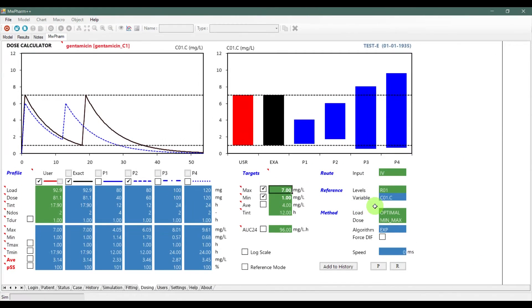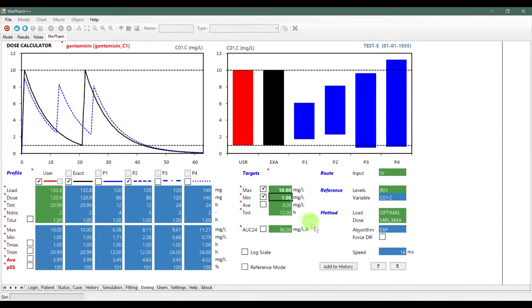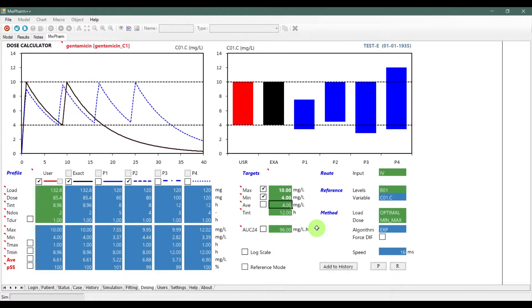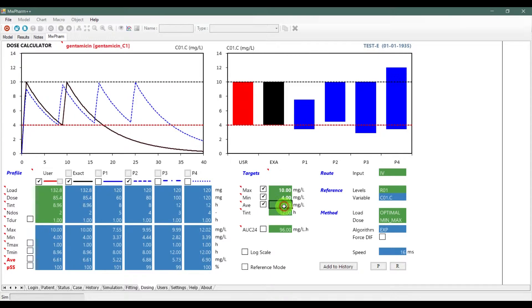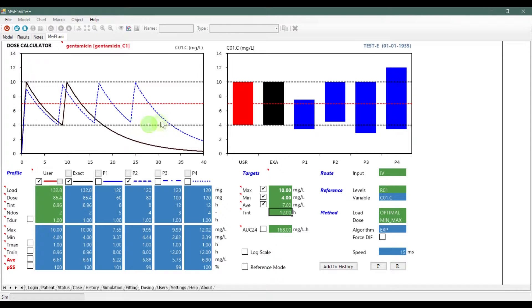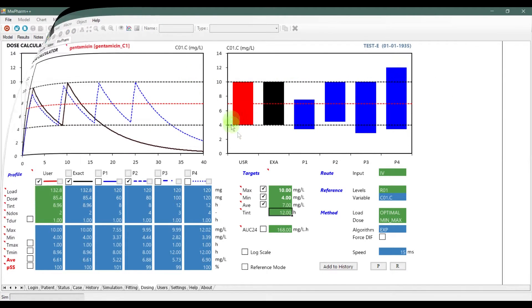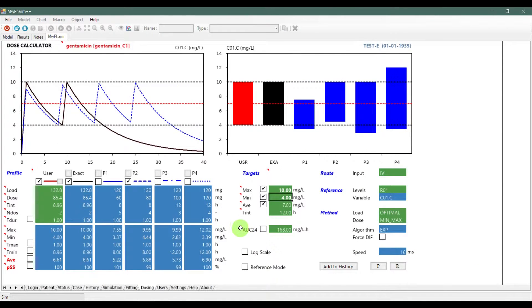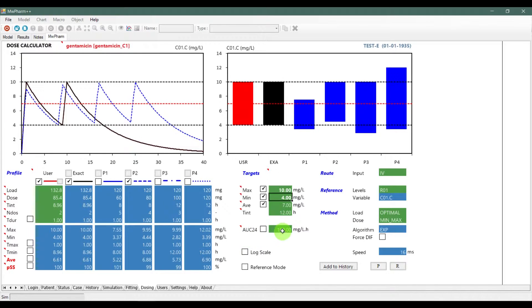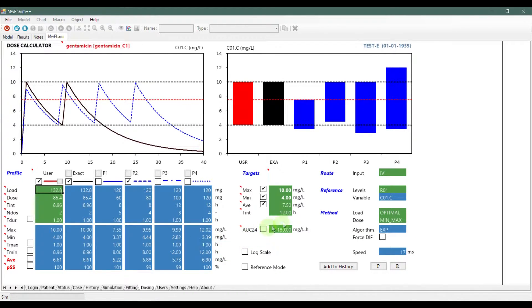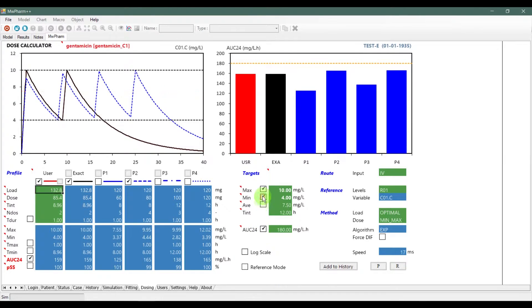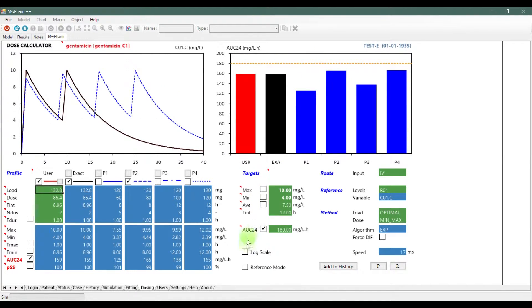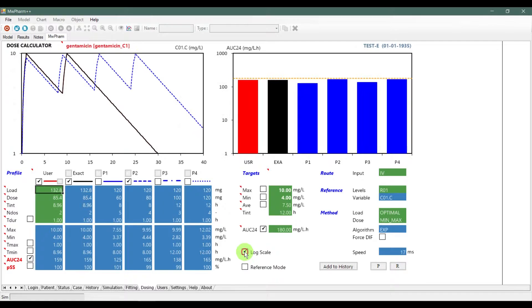In the target section, you can change the maximum and minimum only for this patient and this drug. After switching, you can see maximum, minimum, and average in the graphs above. If you want to activate the AUC mode normalized to 24 hours, select this. Select the log scale to switch the logarithmic scale on your graphs.